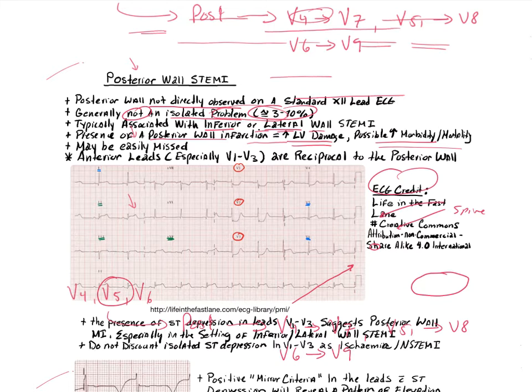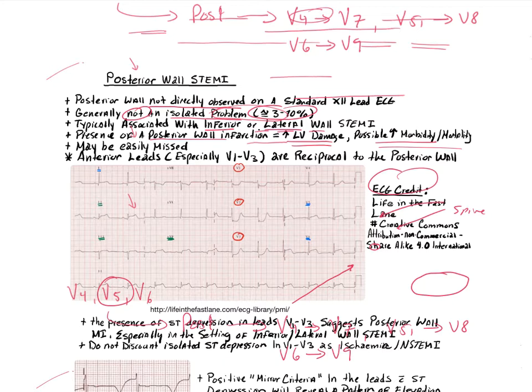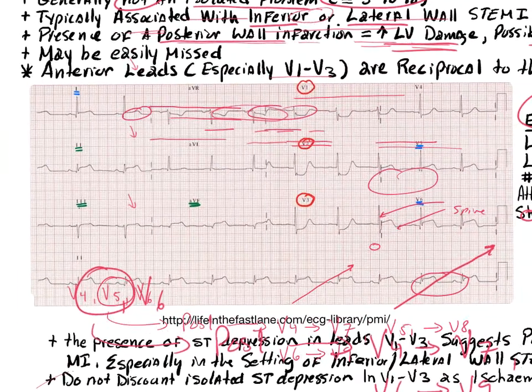I have an ECG image from the website Life in the Fast Lane, which has a Creative Commons license allowing educational use in non-monetized videos. Links to reference these 12-leads are in your notes. Let's zoom in and see what we can see — we'll start at leads 2, 3, and AVF.